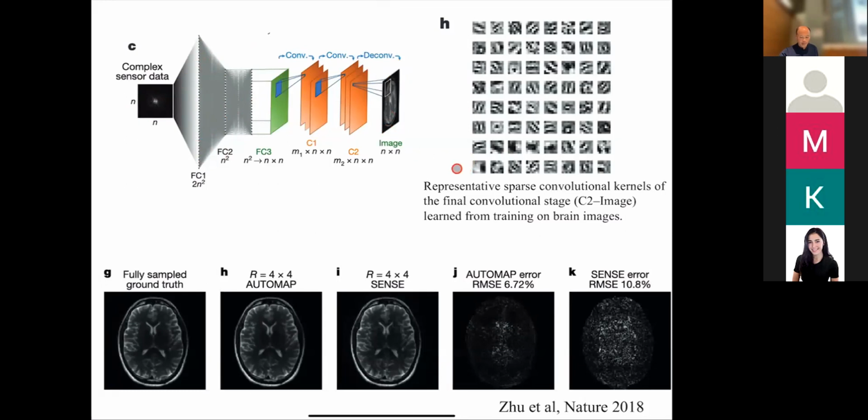And you notice that the basis functions or the features it's finding in your data that correspond to good images, you notice these are some of the features it finds in those later layers. And you can see those look like Fourier basis functions, right? It's very similar to the stripy patterns we showed.